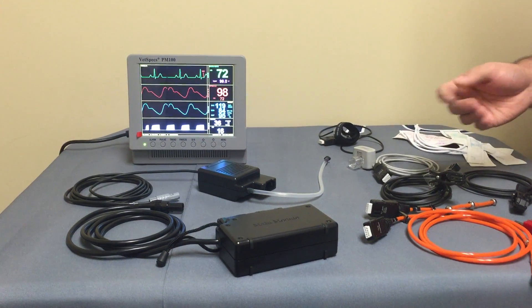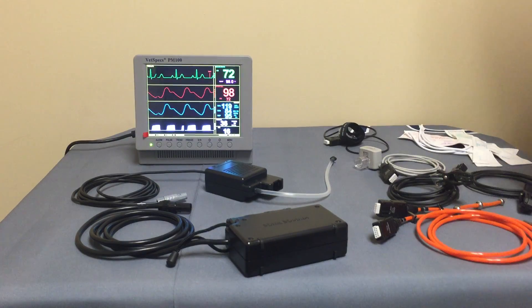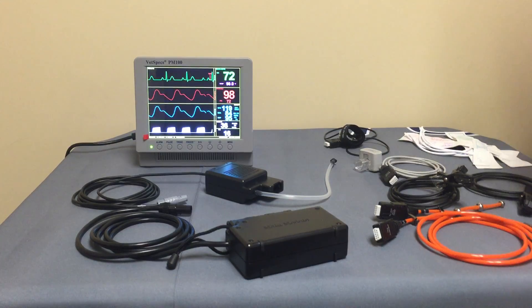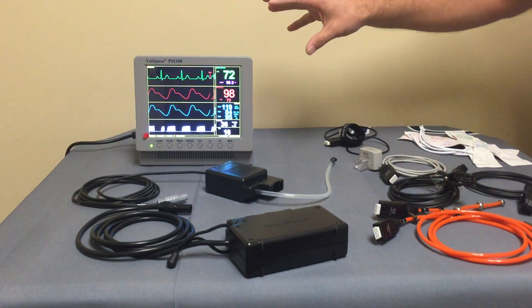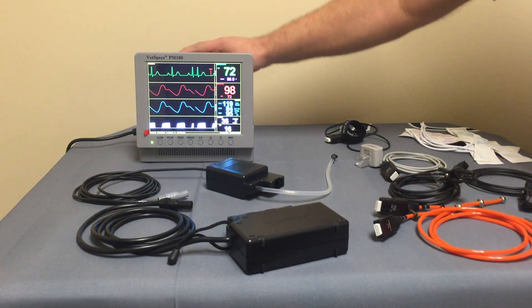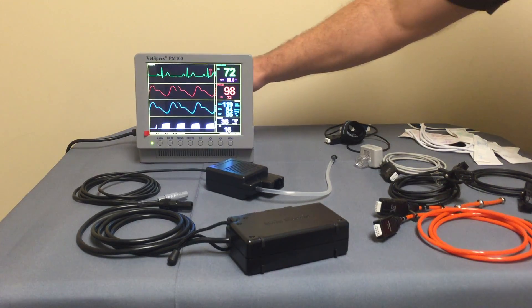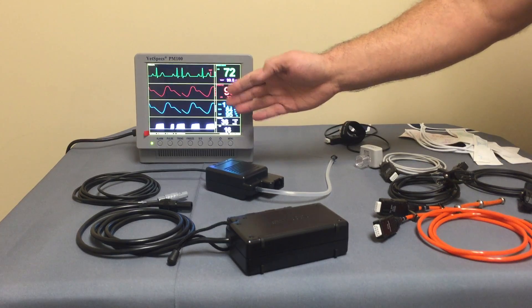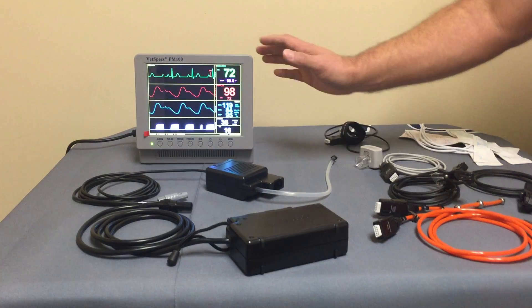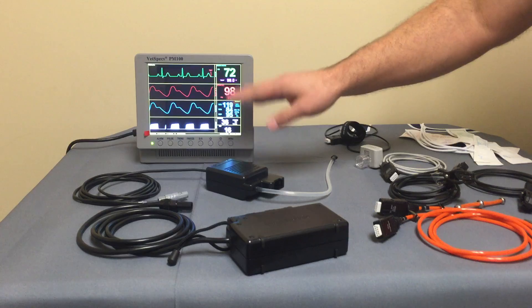Vetspex serves only the veterinary industry and they've evolved over the years. They have gone away from the traditional design of having a monitor box with all of the processing and electronics within the unit. The PM100 unit serves as the power source and the display for the data, with control buttons along the front, but they've externalized the processing portions of the monitor as far as the monitoring parameters.